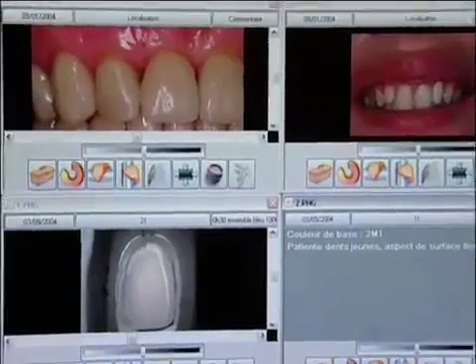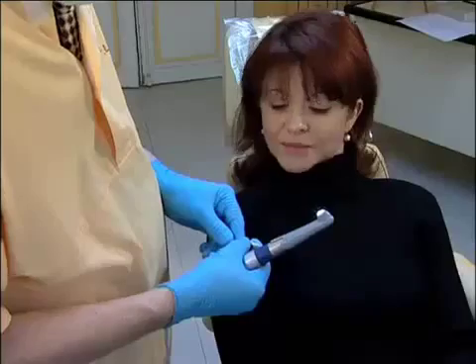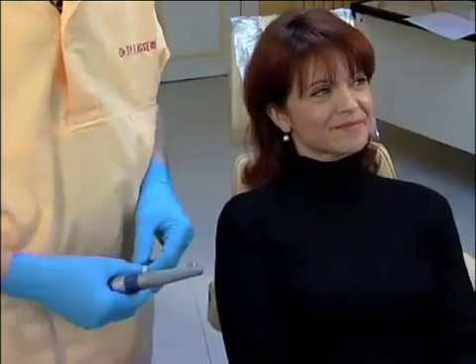With the Sopro imaging software function, it will allow to transfer global images from the patient's mouth together with the results of the shade selection to the prosthesis lab's computer. The fourth quality is the communication with the patient. It is a user-friendly and pleasant tool, and it facilitates the dialogue with our patients around the shade selection.